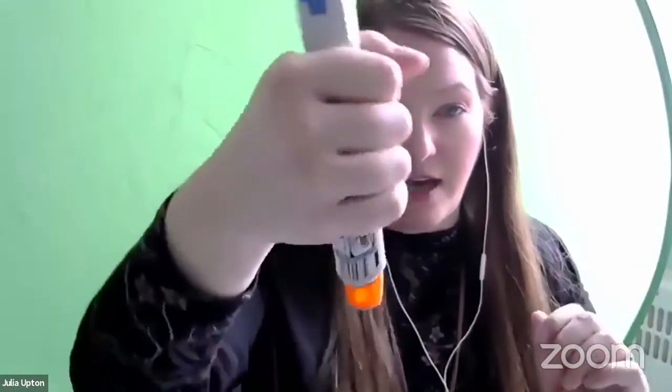Yeah, so for all of them it is quite clear. You hear the click. So for the EpiPen, I don't know in terms of pressure per square inch how much, but it's very doable. And I'll show you. When we advise how to use these, we often say to grip the device with your hand and not put your thumb on the back, just in case you happen to have it the wrong way around. But I think, with the blue to the sky, orange to the thigh, people do tend to have them the correct way around. If you hold it firmly and then push, you'll get a feel for how hard you need to do it if you practice with the trainer. It's certainly very doable. But I would say it's enough that it's unlikely you would do it accidentally.